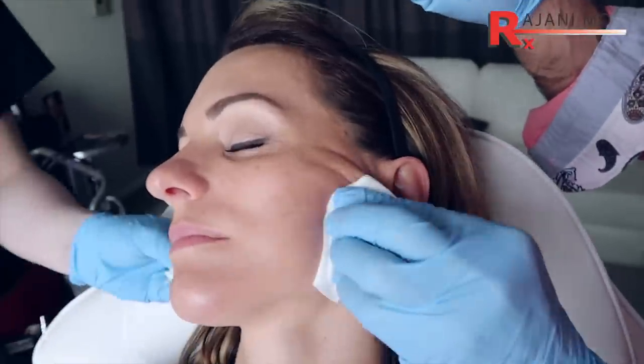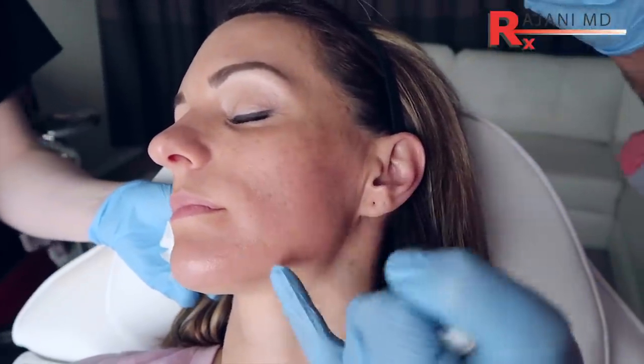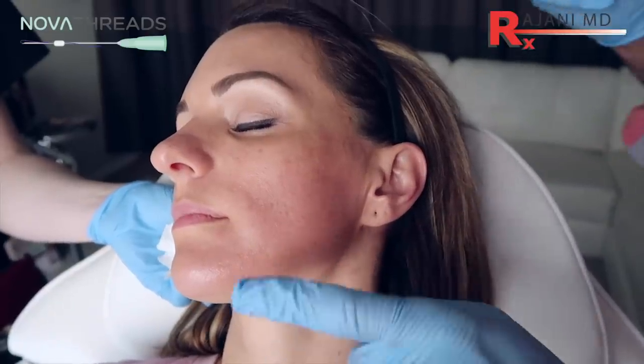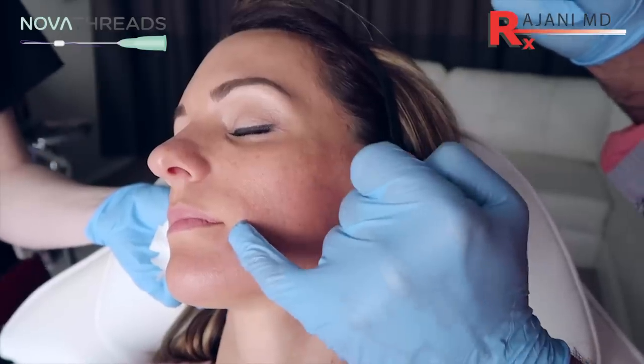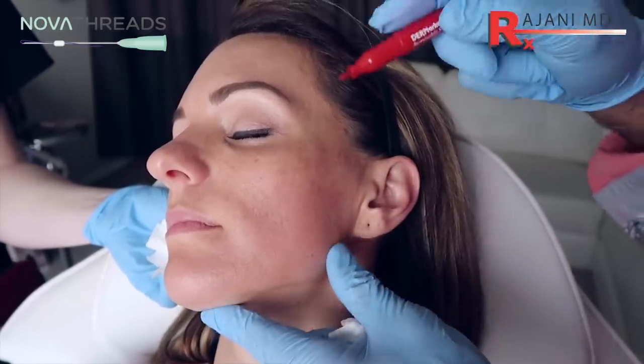We've cleansed our patient already. We do another cleanse. I'm going to place a marking. What we're doing is putting the brand new Barb 4 thread — it's a total cannula thread to lift the edge of the mouth, and I wanted to show the technique of this thread.